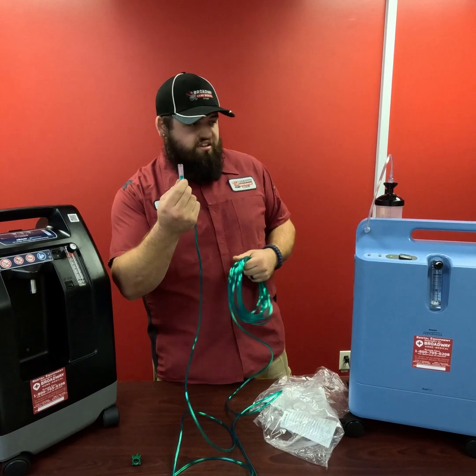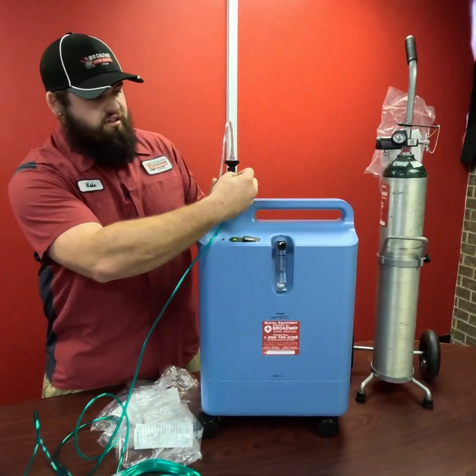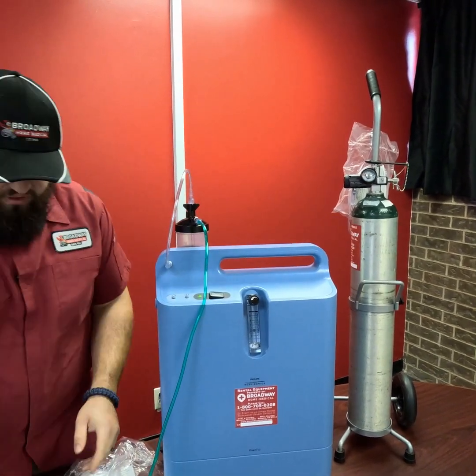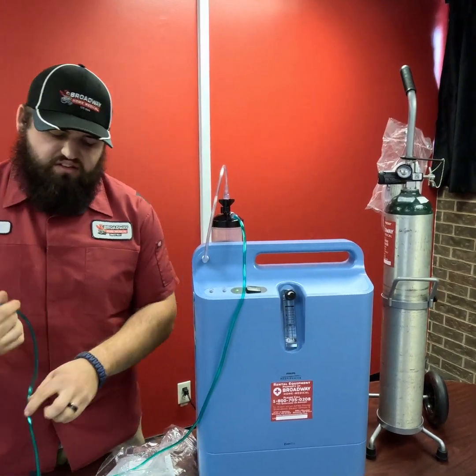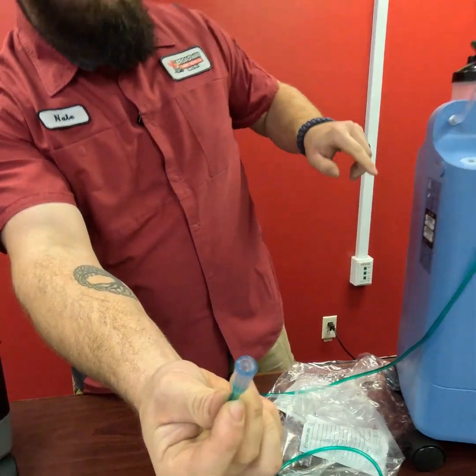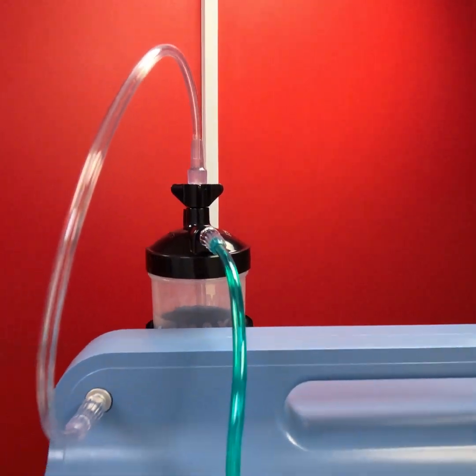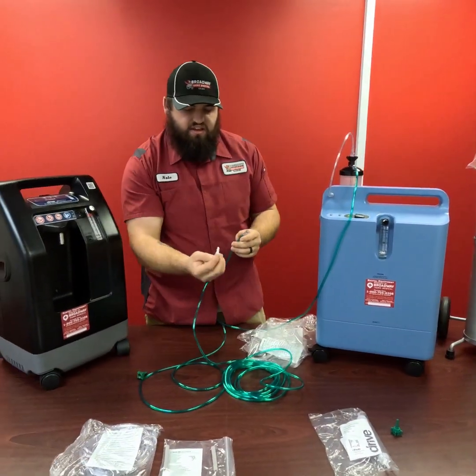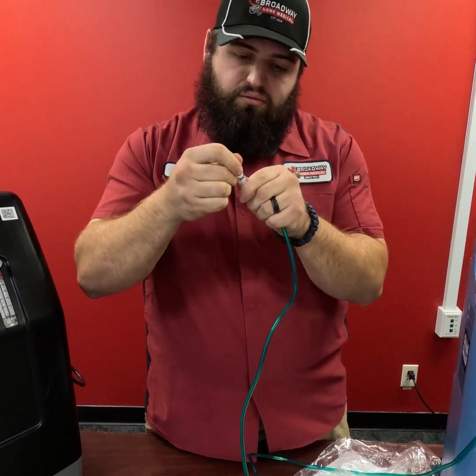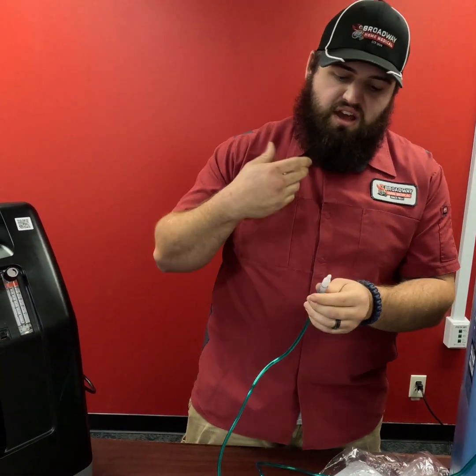So from there, you can actually take this extension tube and plug it into the humidifier jar right there on the end, just like that. And we'll take the other end of this extension tube. You'll see that both ends here are female ends. So we got a female end there, and we got a female end up here. And from there, we're going to want to go ahead and take a connector piece. Now this connector piece is what's called a swivel. It does actually do just that, swivels. And you can actually take and plug this swivel in right there. And now you're ready to plug in either another extension tube or your cannula directly.